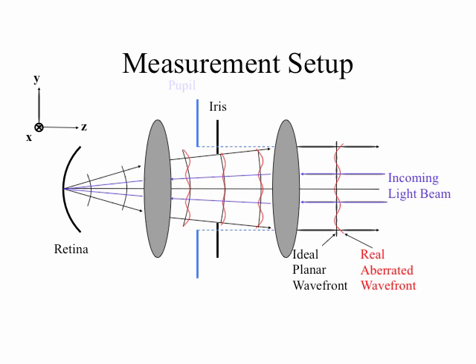Now, imagine what this cohort of photons looks like. Let's say that this cohort of photons, this group of photons, came off of the retina instantaneously from this one point. They're going to form a front that is moving forward in the eye. And I ask you, what does the shape of that front, that light wave front, that cohort of photons, what shape do they describe? And the answer, of course, is that they describe a sphere, or a section of a sphere, like a little bubble that is coming off of the patient's retina, this little bubble of photons.